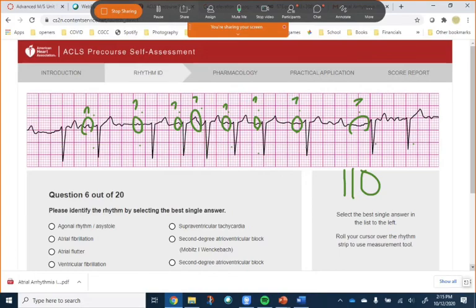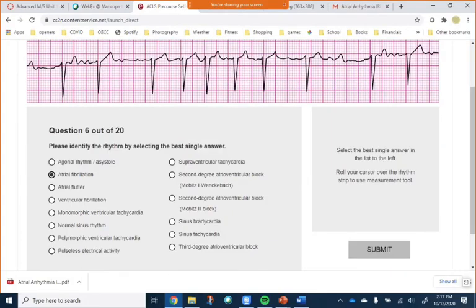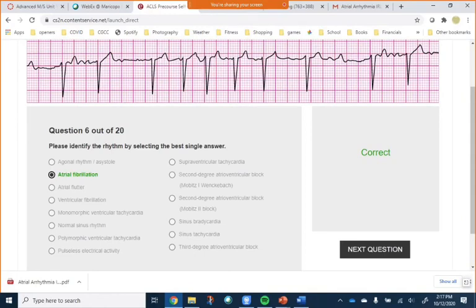So yes, this one is atrial fibrillation because if you look at all of this under here, this is a wavy baseline. It's irregular. It's short, it's long, it's short, it's long. But it is definitely in the atrial category. There's something wrong with my P waves. So to call it a block, you need clear P waves that you can measure. If you can't and it's got an irregular rhythm, then you just call it AFib. It is what it is. It is wavy, it is weird looking, and you would be correct. It's an atrial fibrillation because that atrium is not doing anything regular at all.